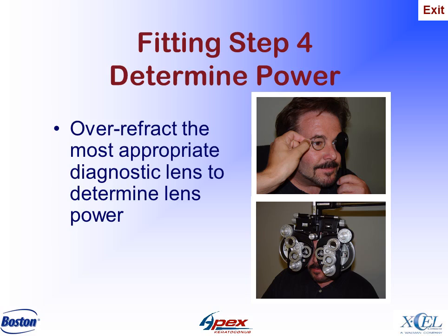Finally, perform a spherical refraction over the most appropriate diagnostic lens to determine the power to be ordered. In keratoconus, it's not uncommon to have some residual astigmatism due to the irregular cornea, but this cylinder component should not be incorporated into the Apex lens design.